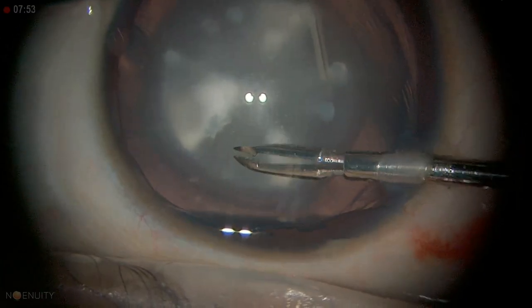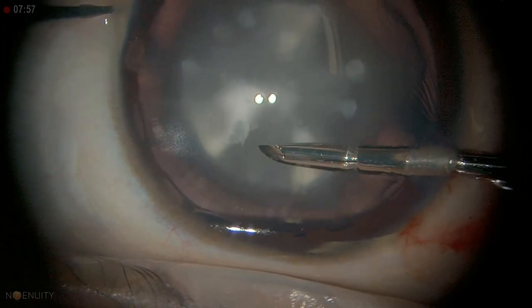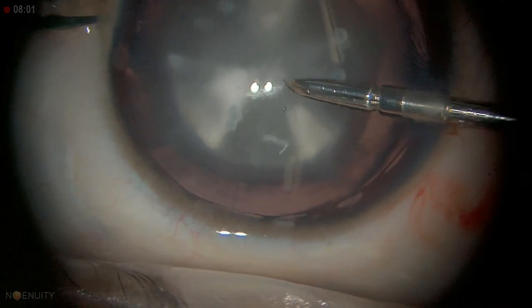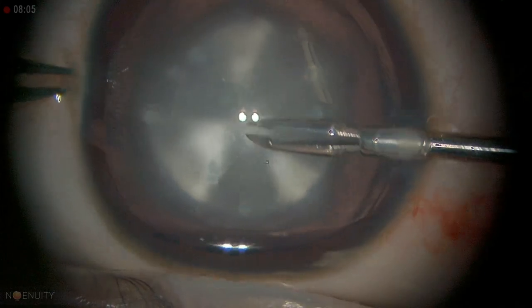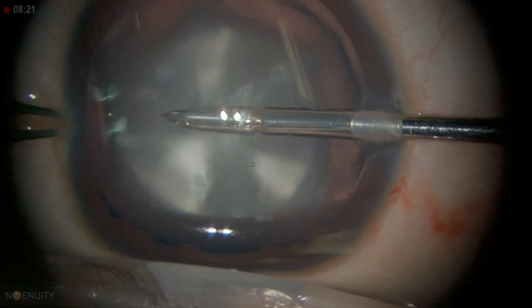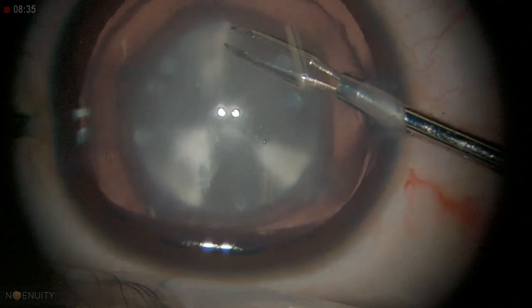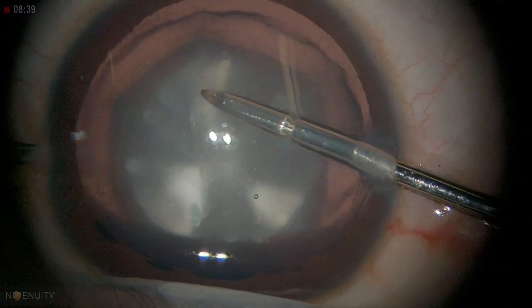Now I'm going to use the rhexis forceps — grasp it here. You can see the rhexis has started. Grasp and regrasp. In the beginning stage if you are not comfortable you can use trypan blue as well. I use the shining surface of the anterior capsule as a guide.